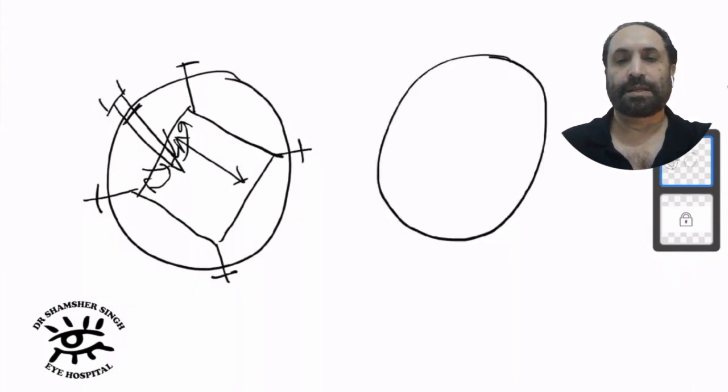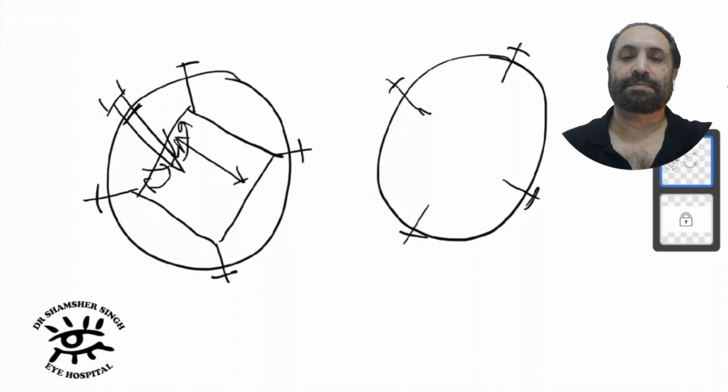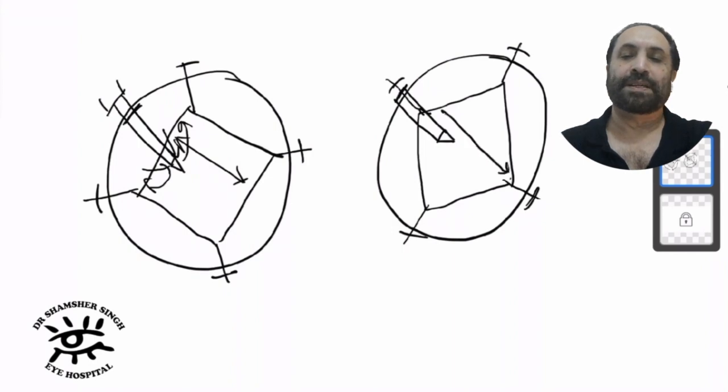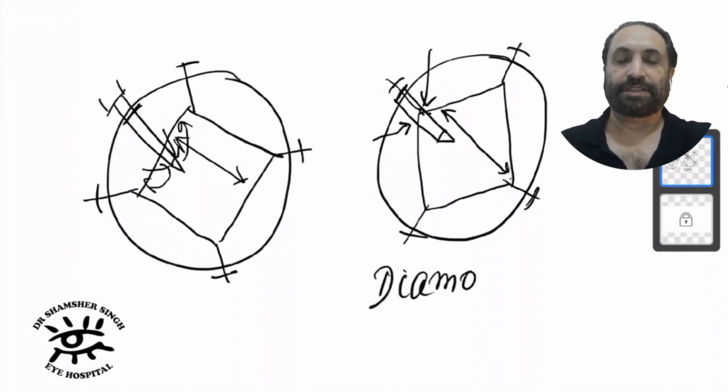An easier method would be to just rotate your iris hook configuration by 45 degrees — so the iris hooks are about 45 degrees anti-clockwise. The configuration now looks like a diamond. Your phaco tip goes over one of the iris hooks. In this case the excursion is from one apex to the other, which is more. And the iris hook is pinning down the iris, so there is no chance of the iris getting stuck into the phaco tip port. This is the diamond configuration, and I find it is much easier to use.